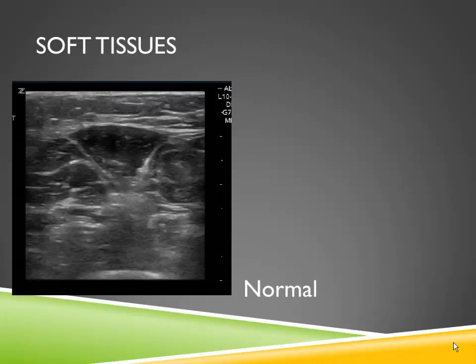So it's important to remember what normal tissue looks like and differentiate this from abnormal, and I'm going to show you some examples. What I recommend when you look at these infections is you start with your probe on an area that appears normal, scan all the way through the abnormal section, and then get back to normal tissue again, so you can see the real differences and the real borders of the problem area.